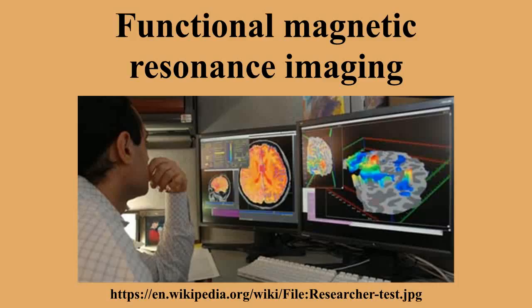Tumors. Check left-right hemispherical asymmetry in language and memory regions. Check the neural correlates of a seizure. Study how the brain recovers partially from a stroke. Test how well a drug or behavioral therapy works. Detect the onset of Alzheimer's, and note the presence of disorders like depression.